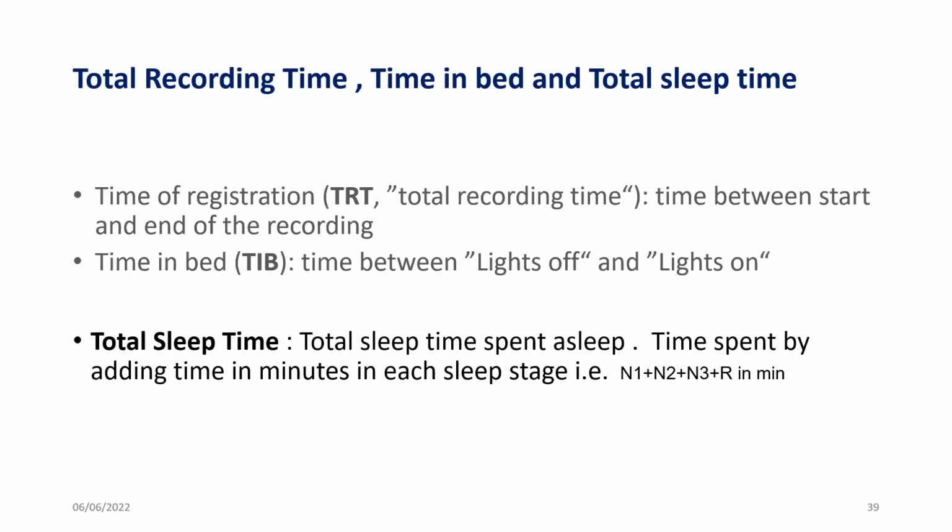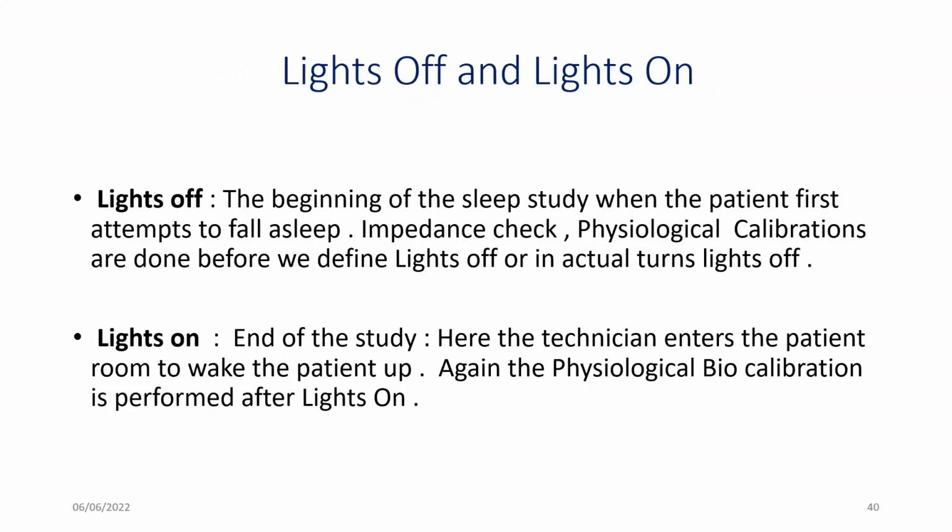So how do you define time in bed? I told you, lights off and lights on. So lights off is basically the beginning of the sleep study.